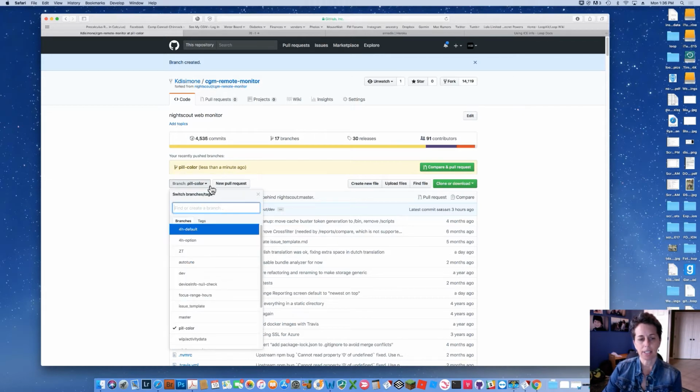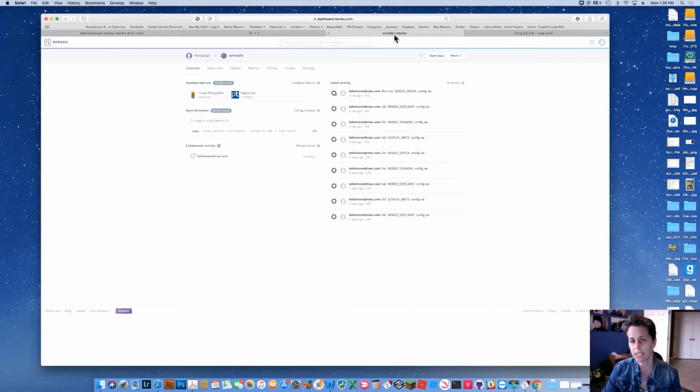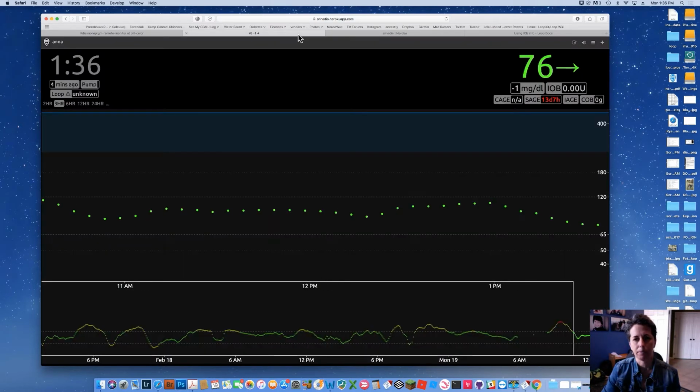And I can look at this and say, okay, I'm in pill color. And the reason why I want to do that is because maybe I just want to test some things out and make it personal to myself. So I'm going to call this one pill color. So let's say I want to go to Anna's website and say, okay, I want to change some of these things. I just want to add a splash of color somewhere.